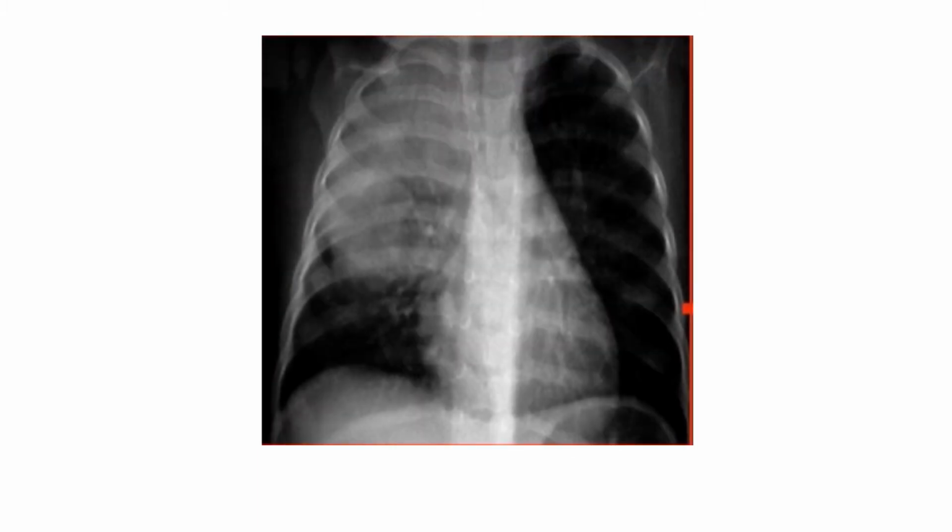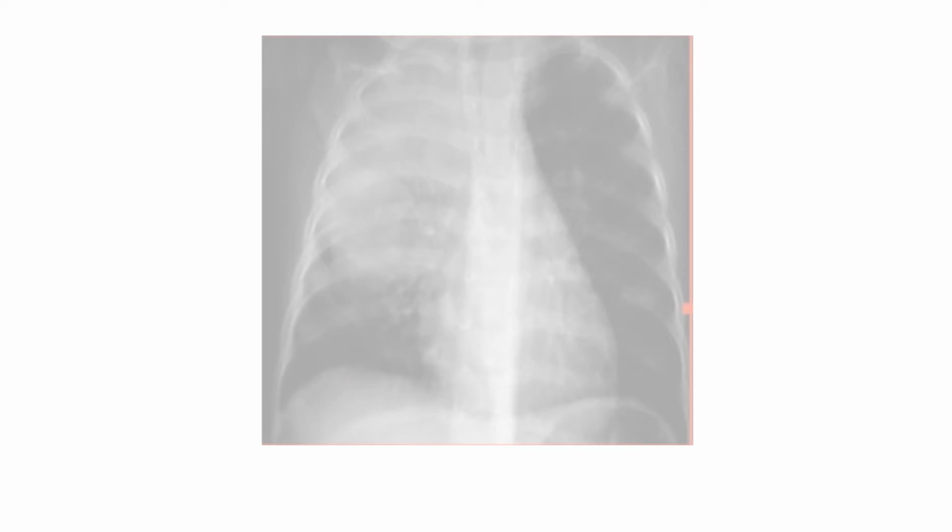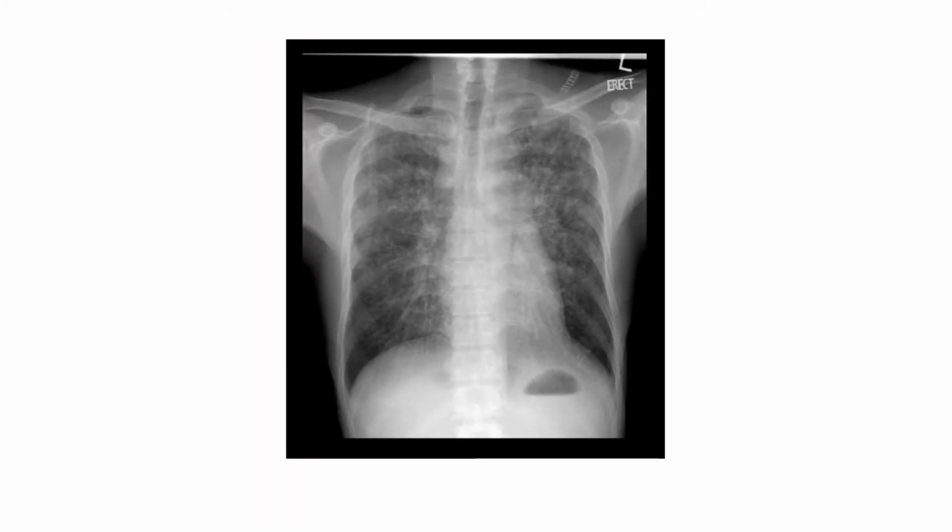So as clinicians, we see X-rays and CT scans every day, and as well-trained individuals, we are all very, very smart. When we see something like this, we will say, oh, this is a Klebsiella pneumonia, isn't it? This is a bulging fissure sign. And when we see something like this, we will say, yeah, this is pulmonary tuberculosis. So we are very smart, and we can almost make a microbiologic diagnosis from just an image. But is that really true or not?